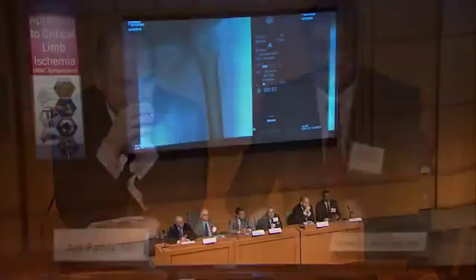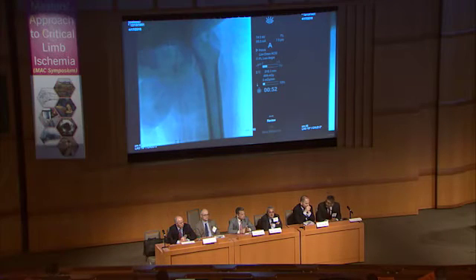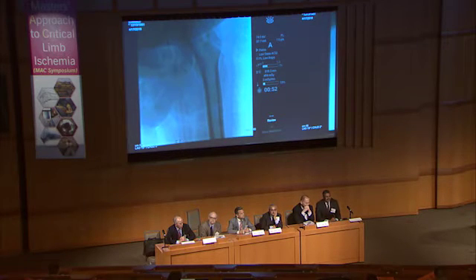No, I think more information is better, clearly here. It's a complicated case. I think the embolization procedure is going to be a full day's work in and of itself. Exactly. So probably that's not something you're going to be able to accomplish today after treating the SFA.